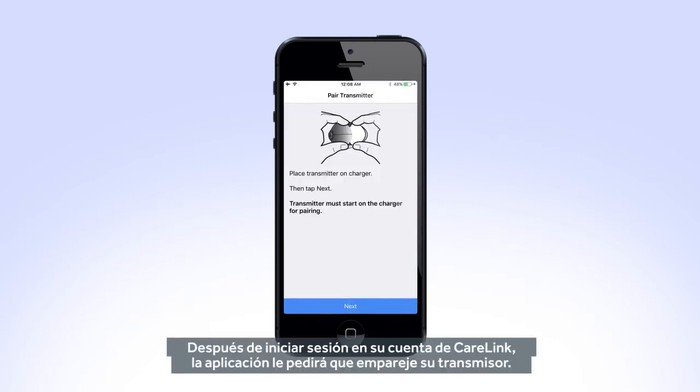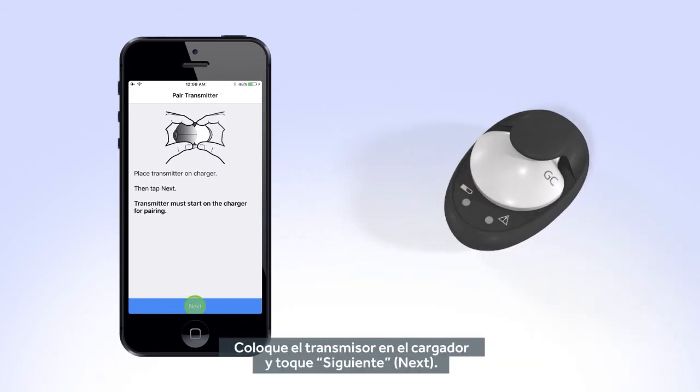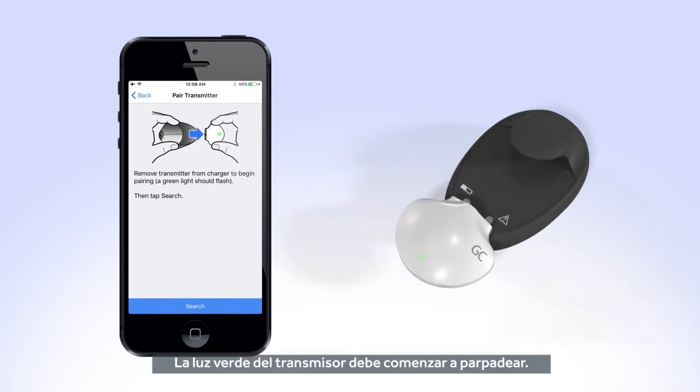After logging in to your CareLink account, the app will ask you to pair your transmitter. Place the transmitter on the charger and tap Next. The next screen will tell you to remove the transmitter from the charger to begin pairing. The green light on the transmitter should begin to flash. Next, tap Search.